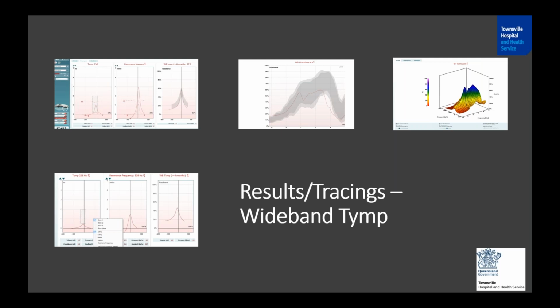Yes, I think that's what I understood. Theoretically, yes. But it is a very interesting combination, with one being the opposite of the other. There can be otosclerosis and then, let's say, a flaccid tympanic membrane. I'm not too sure what kind of patterns we would get, because they are opposing. Technically, yes, we should see a difference around the 1 kilohertz mark, but I really don't have any patterns with such pathologies. Theoretically, it should be able to pick up both the otosclerosis and the flaccid tympanic membrane.